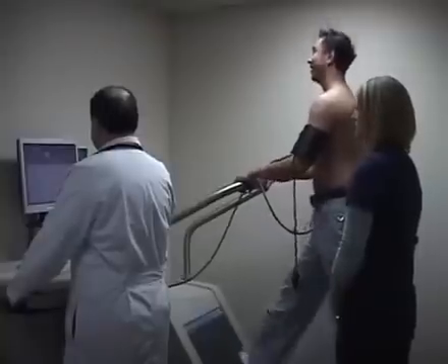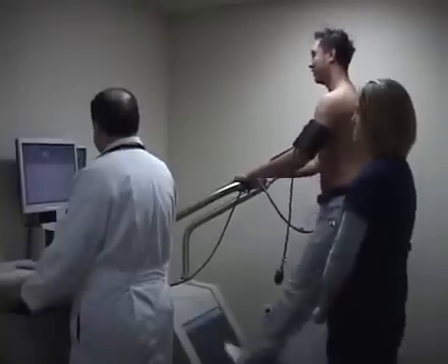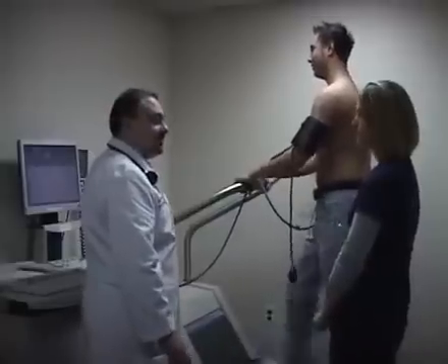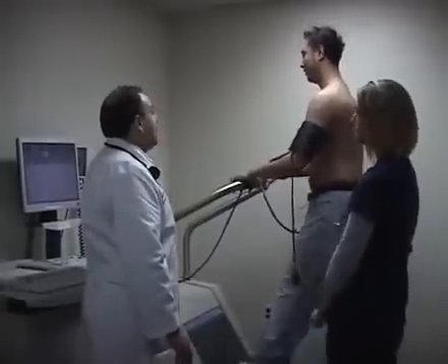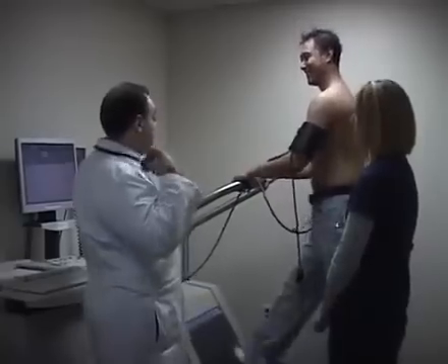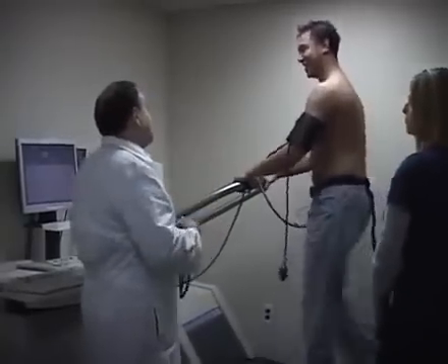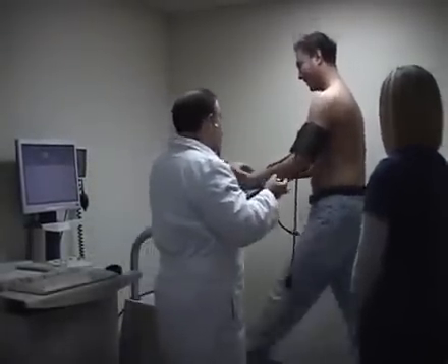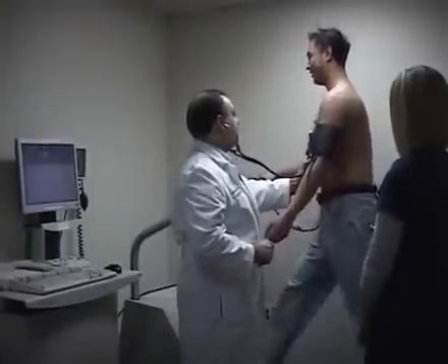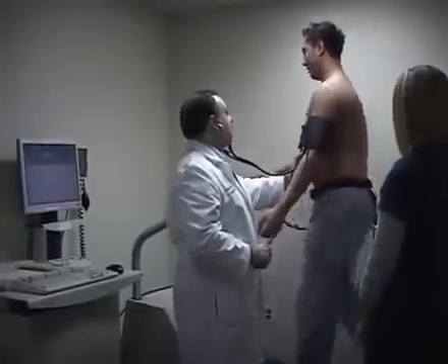Right now I'm looking at the EKG tracing on the machine, making sure that the patient doesn't have any specific EKG changes that could correspond to a significant blockage in the arteries of the heart. My assistant Nicole is checking the blood pressure every so often to make sure it doesn't go too high during the treadmill stress test.